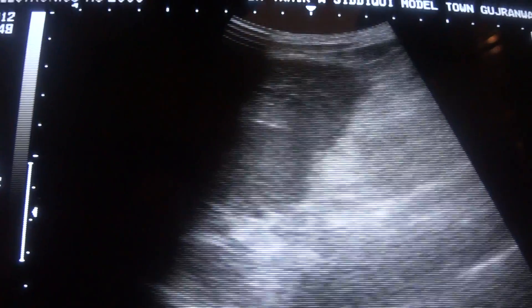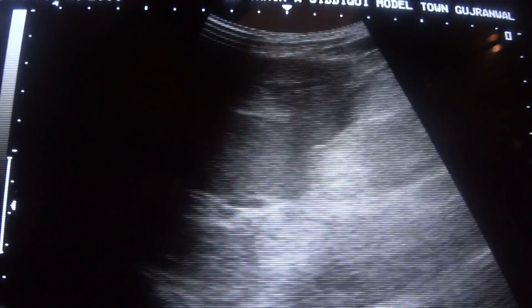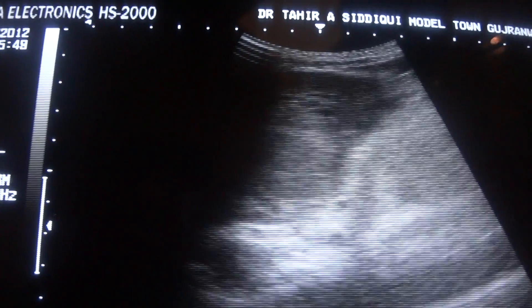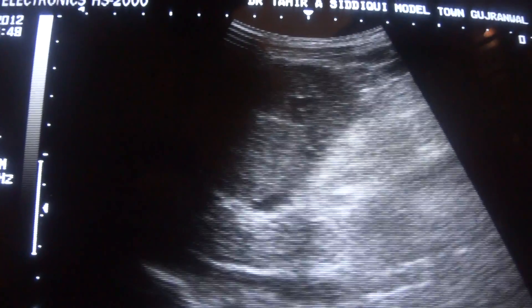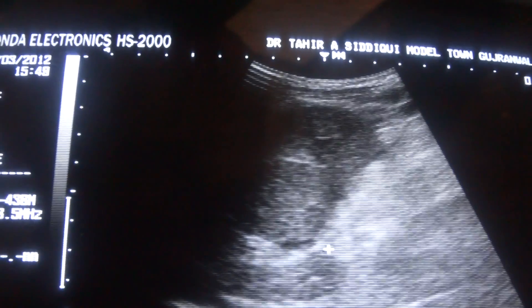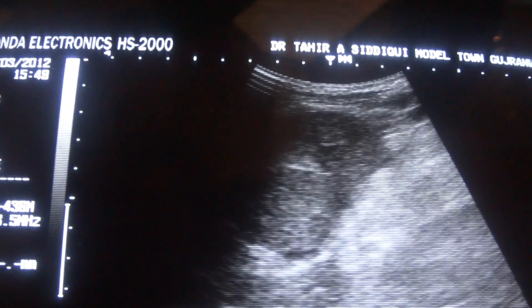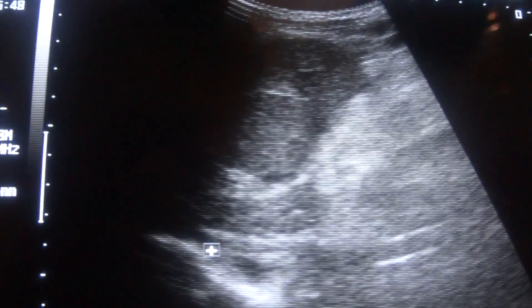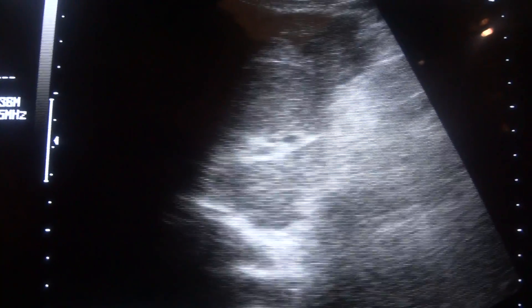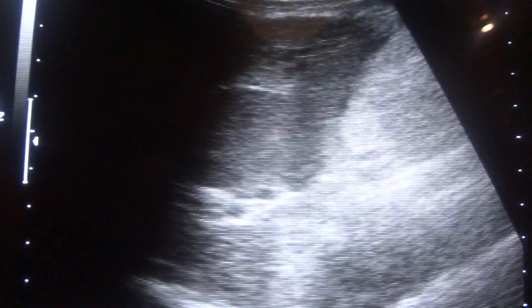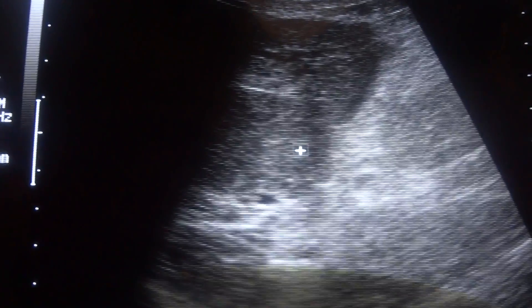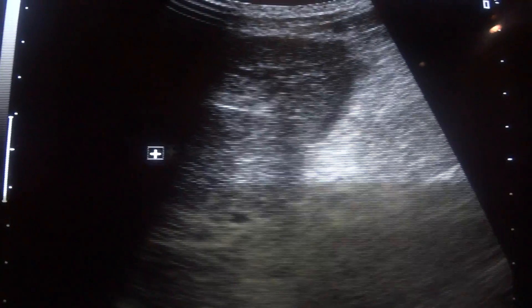Now this is the longitudinal section of the left lobe of the liver. This is the caudate lobe; IVC is down here. This is the ligamentum venosum. And this is the focal mass.